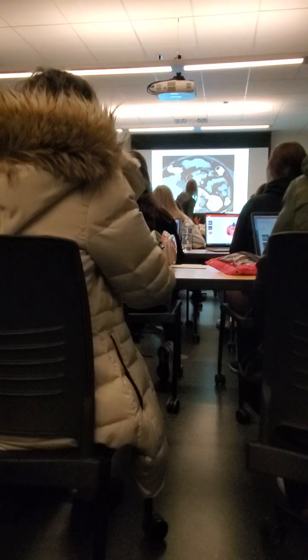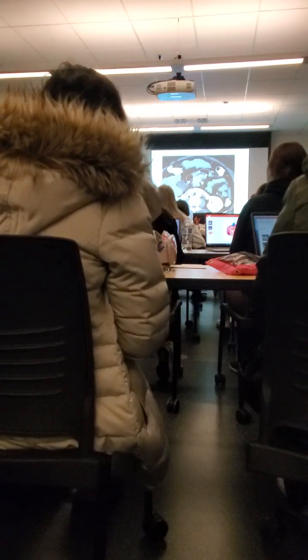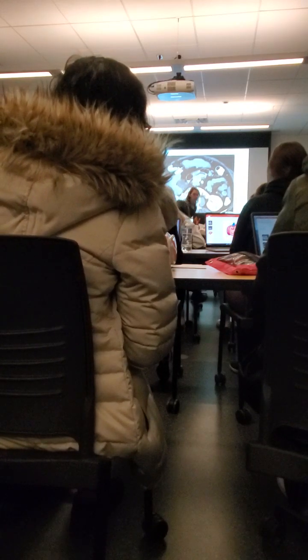Connor, on the CT images, could you show me the liver again? I just wanted to know if it was a healthy looking liver. It seemed brighter than the other image. There is something going on here, and look how lobular it is. Before that, the other image looked okay to me.